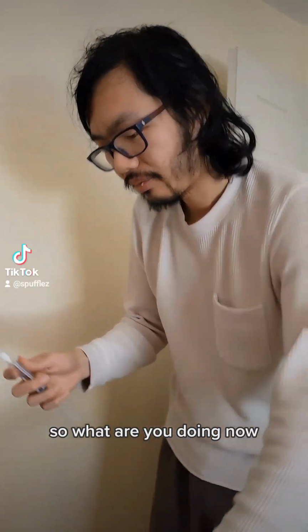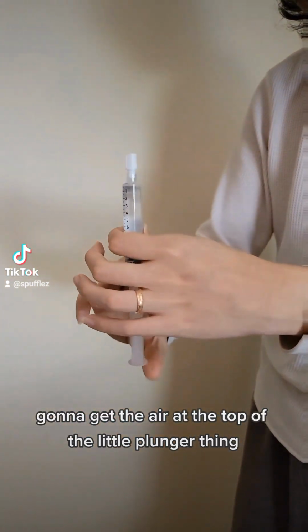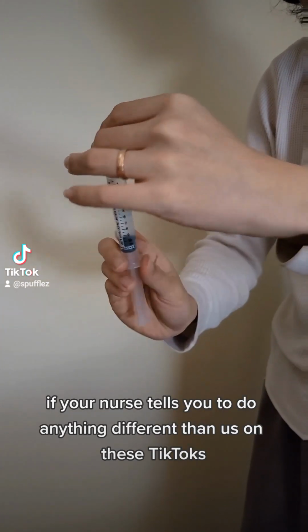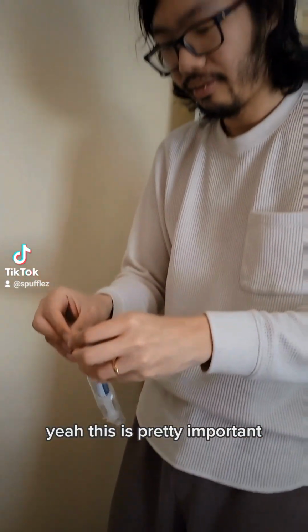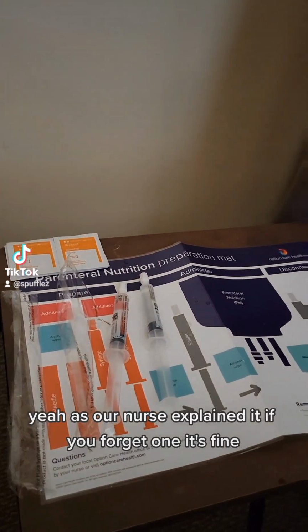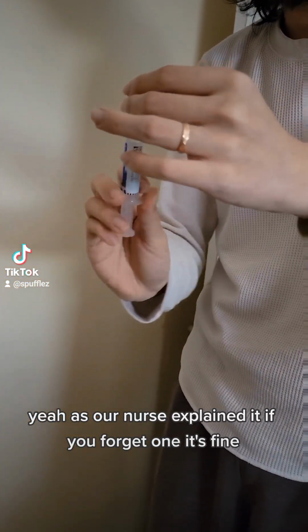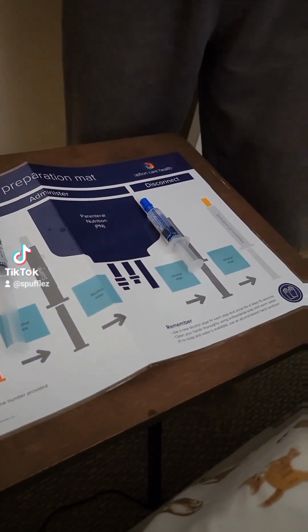So, what are you doing now? Gonna get the air out at the top of the little plunger thing without actually opening it. Remember, if your nurse tells you to do anything different from what it says on these TikToks, listen to your nurse instead. But yeah, this is pretty important. Gotta make sure I don't get an air bubble in my PICC line. Yeah, as our nurse explained it, if you forget one, it's fine. If you forget all of them, you're trying to claim life insurance.